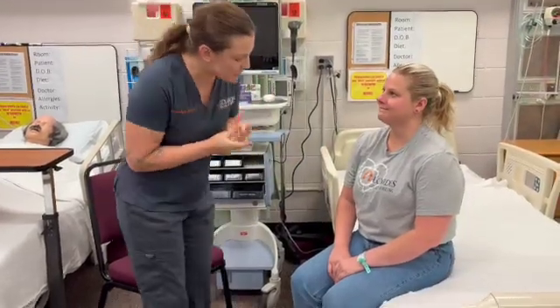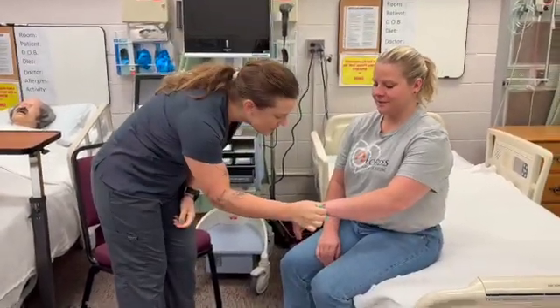Mary Smith. And your date of birth? 1-1-2001. Perfect. And then do you have any allergies, Mary? No.